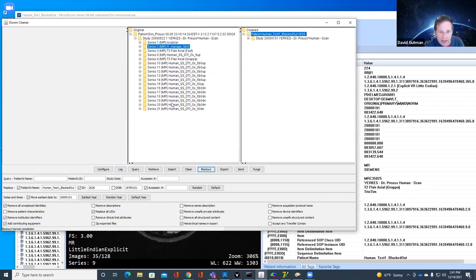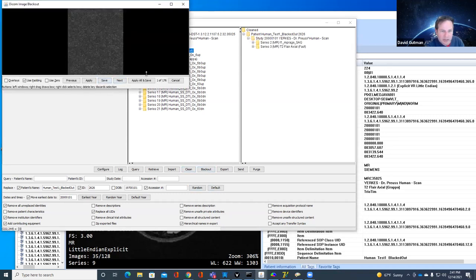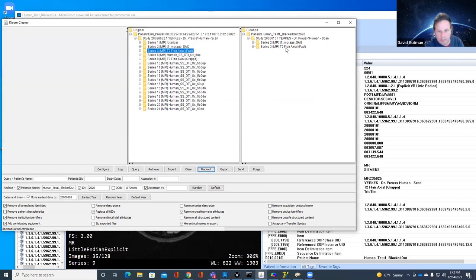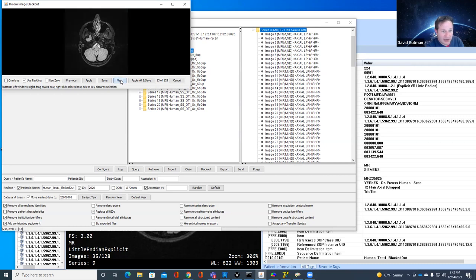The blackout is now complete. I also want to do the T2 axial FLAIR — I hit clean. Now I'll do the blackout. Since this is a different series, it's in a different orientation and a different image, so I also have to do the blackout for the second image. It's actually pretty easy to do. Now it's applying to 128 images.